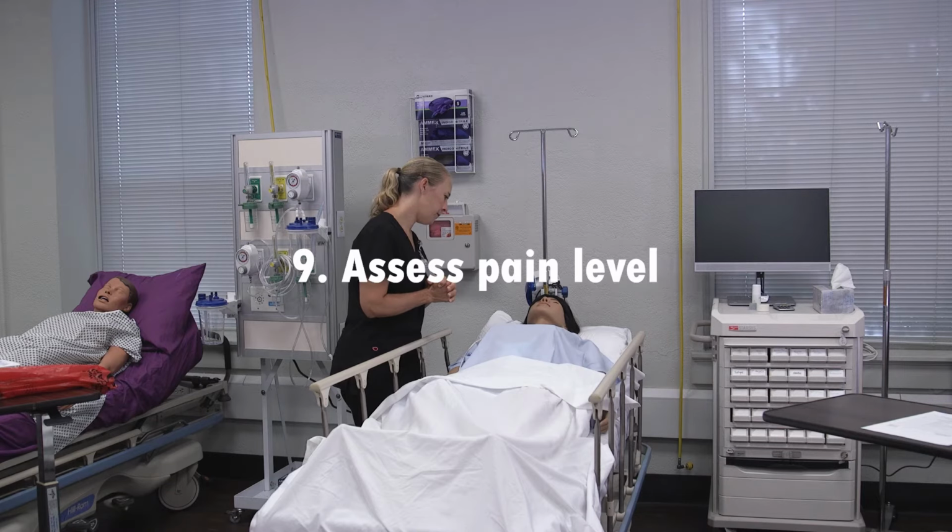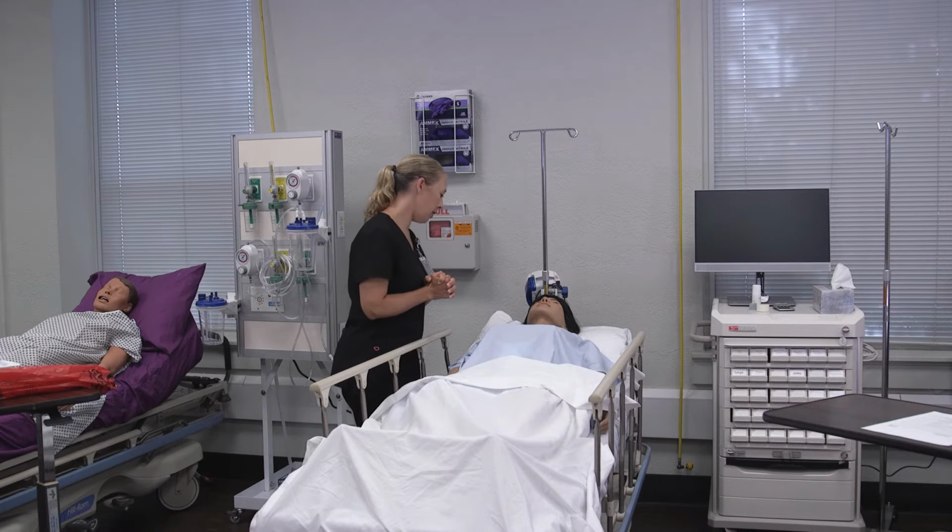Assess pain level. Are you having any pain right now? Just a mild. Okay. On a scale of 0 to 10, with 0 being no pain and 10 being the worst, how would you rate that pain? I would rate it on a level of a 2. A 2? Okay. And where is it that you're hurting? Just my abdomen. Okay. And how would you describe the pain? Is it aching? Is it throbbing? Is it just kind of a soreness? Just a soreness. Okay. Well, if you start to hurt worse while we are doing this dressing change, please do let me know.